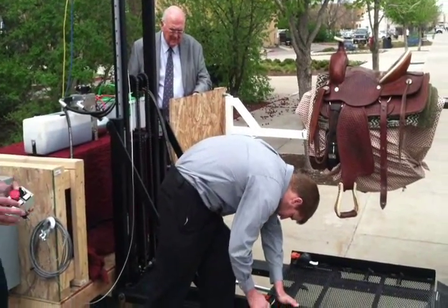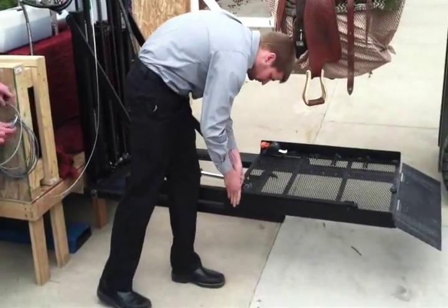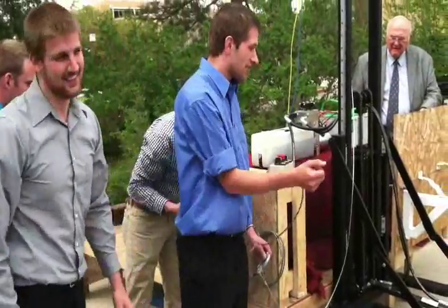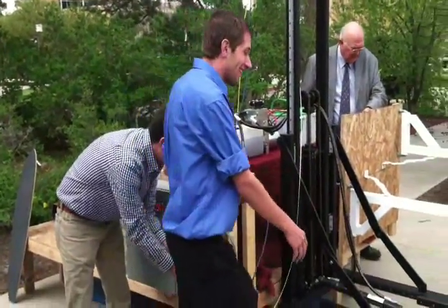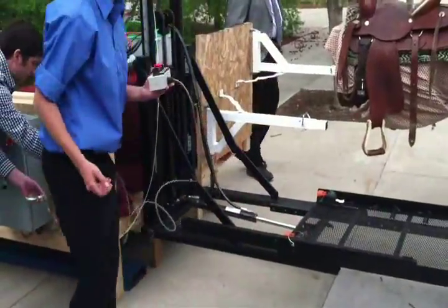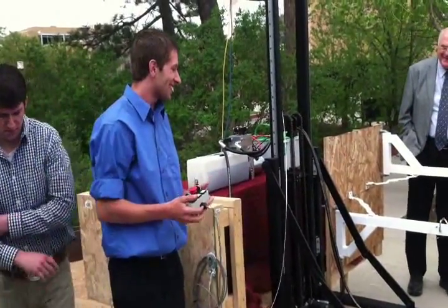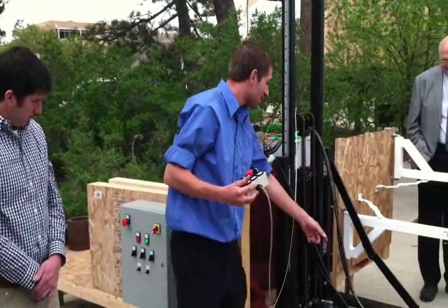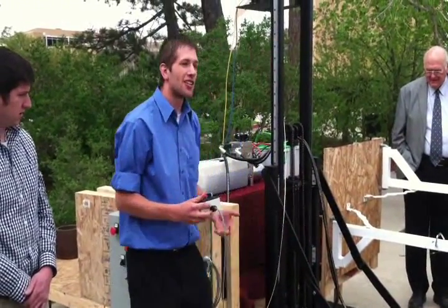So after the horse restraints are pulled out, the handle is lifted up, and the safety restraints are holding the rider, they can operate the system. This system operates using two hydraulic cylinders — the in-and-out cylinder, which we had to make slower in testing, and the vertical cylinder.